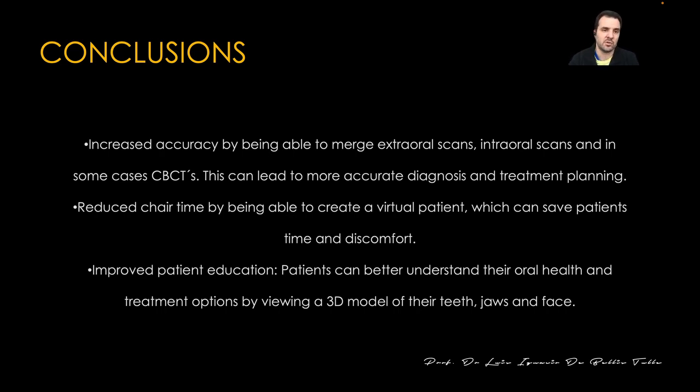So, to conclude this, I think that we have increased accuracy by being able to merge extraoral scans with intraoral scans, and obviously, in some cases, merge the CBCT to all this data so that we can get a better result. We reduce chair time, so it's great because we don't need to have the patient sitting beside us while we are working. We just take all this data from him and send it to the local lab, or whoever wants can work on their own with all this.